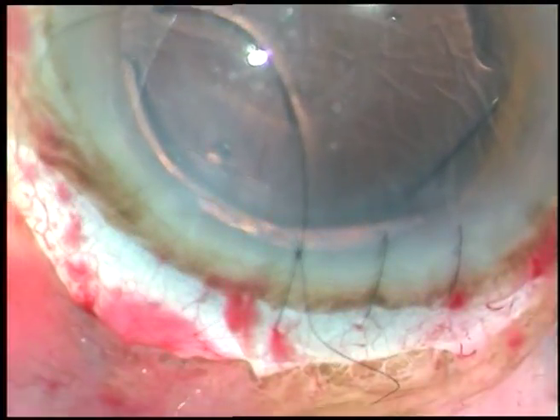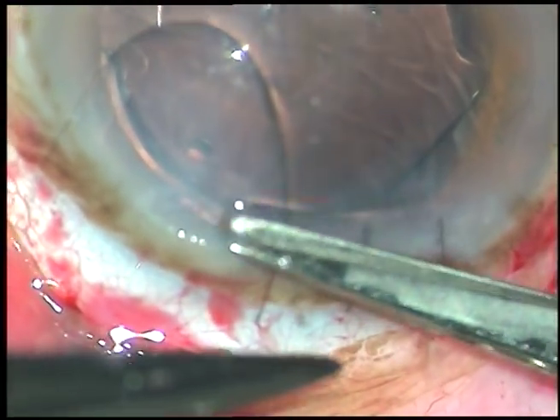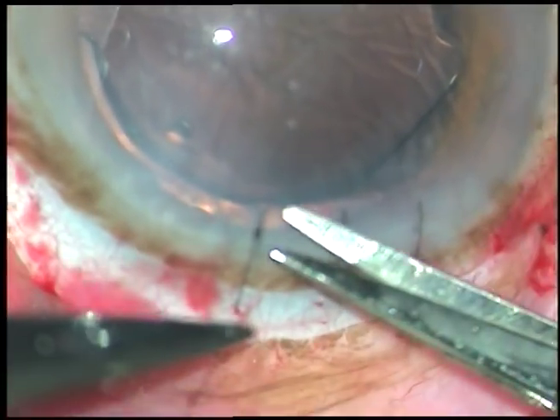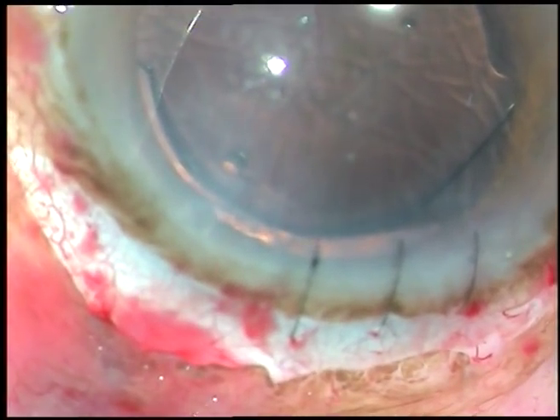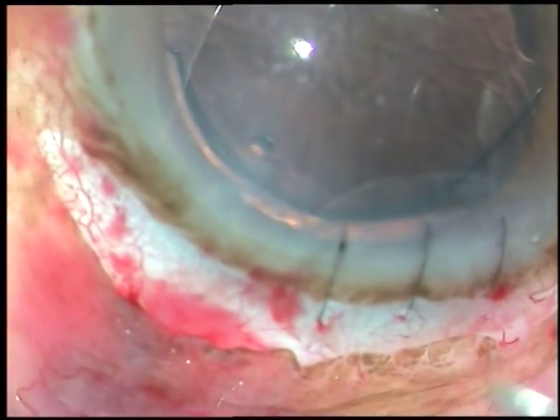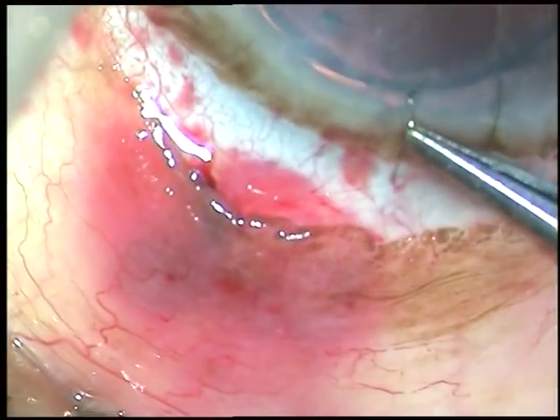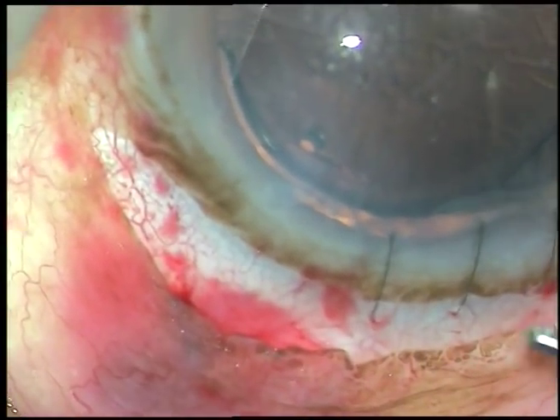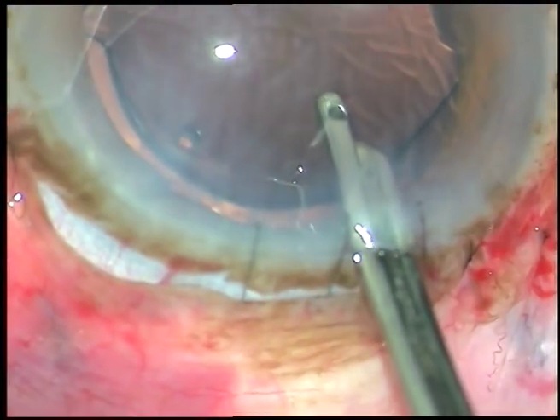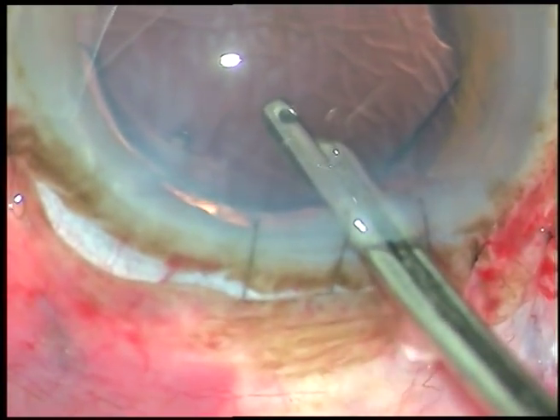All the sclerotomy sites are closed with 7-0 Vicryl, and that has been edited out. The knots are buried in the tissue so that irritation doesn't occur. These are 10-0 nylon sutures, and finally the anterior chamber is formed. Some irrigation of BSS is done like this, so that the intraocular pressure becomes normal.